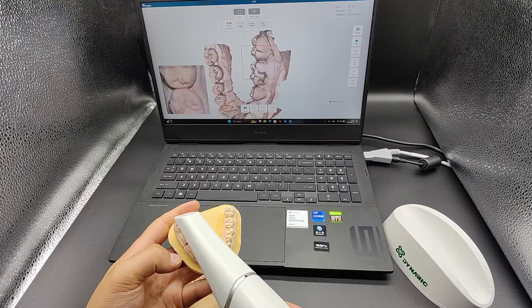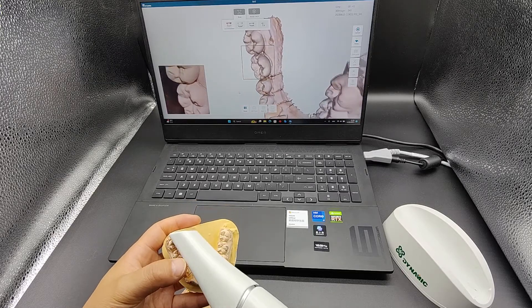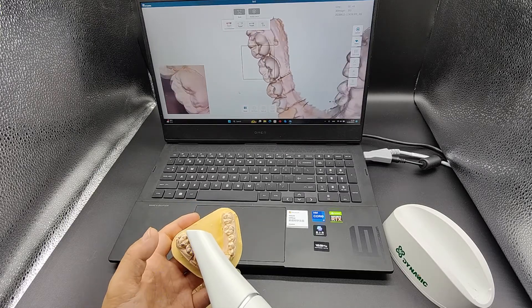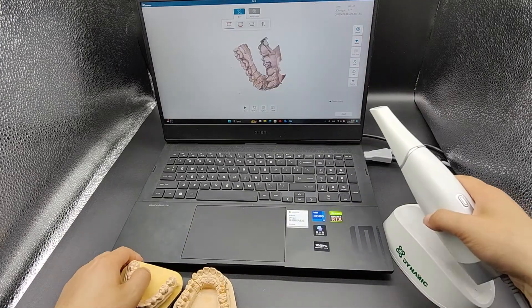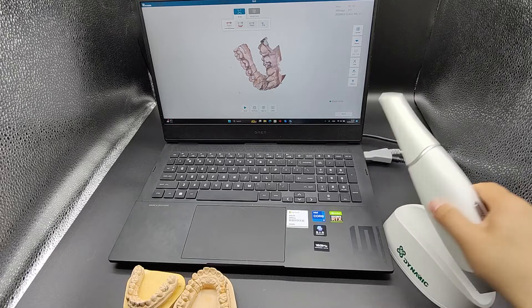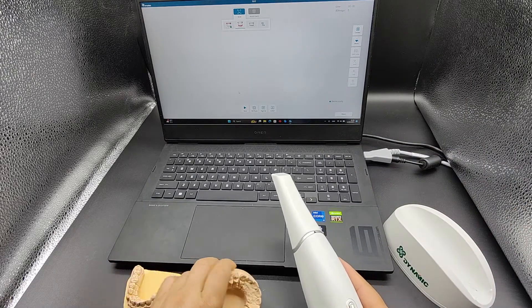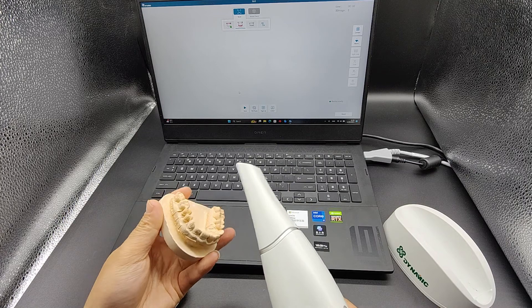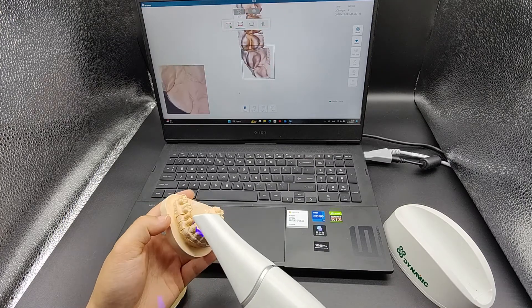If re-scanning is needed in the anterior teeth area, it is recommended to place the scanner on the posterior teeth first, and then move to the area that needs to be re-scanned after they have been recognized. The scanning method and sequence for the upper jaw is the same as that for the lower jaw.